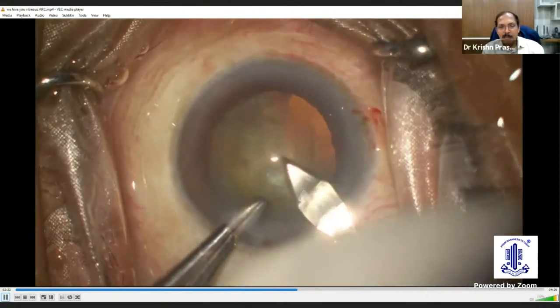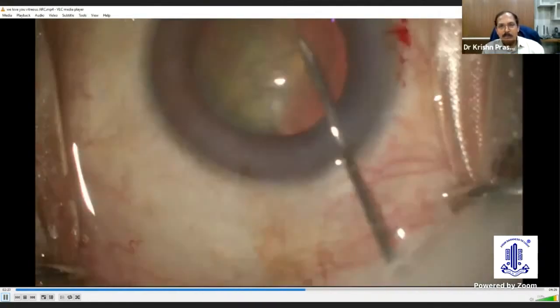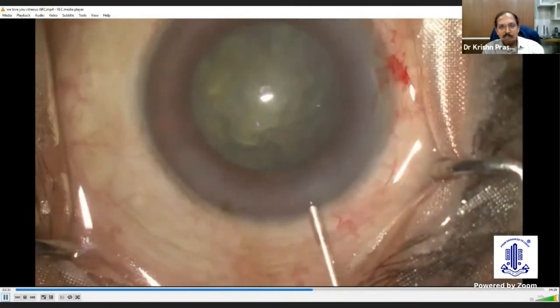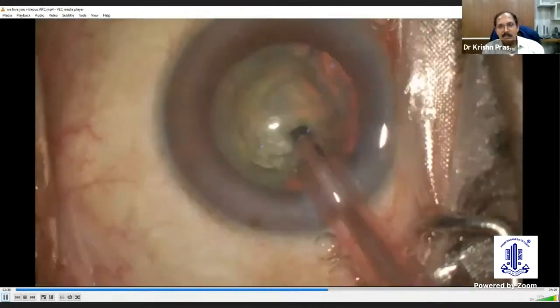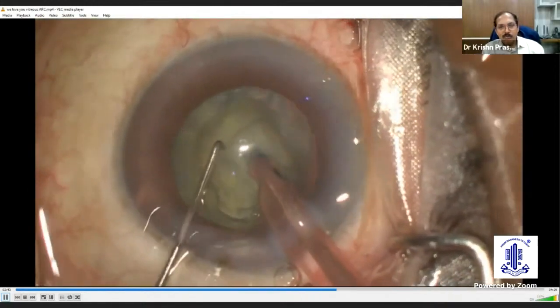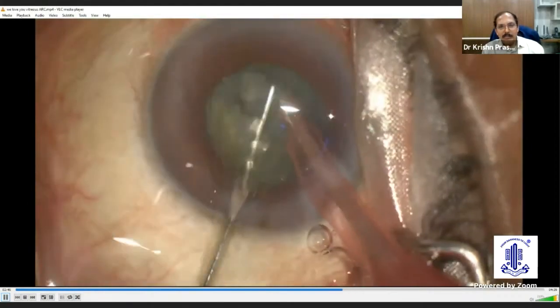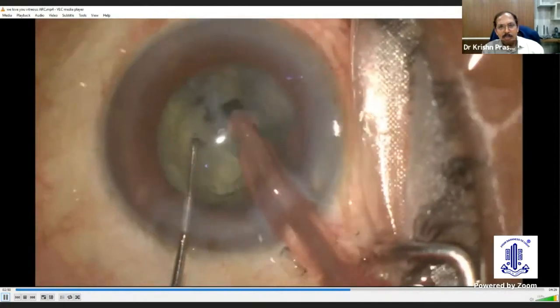He is expecting a problem. He makes his incisions but does not do any hydrodissection. He just tries to mobilize the nucleus minimally, and has also kept his IOP low. He breaks the nucleus and is now trying to remove it without dialing — avoiding any excessive manipulation.